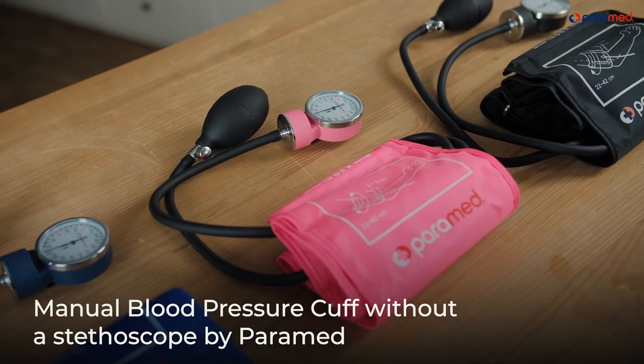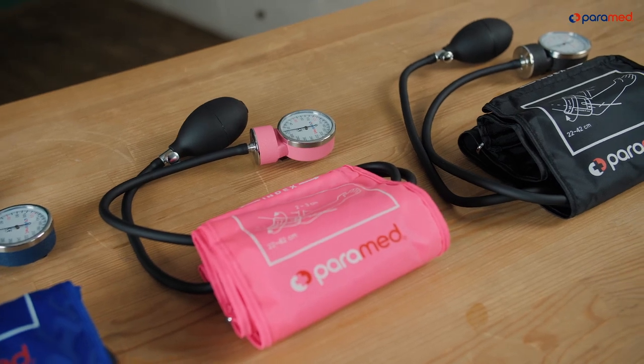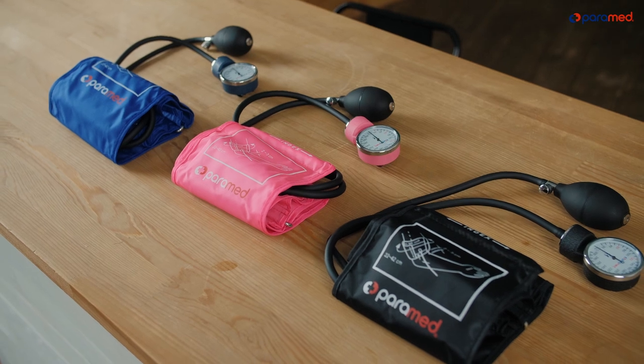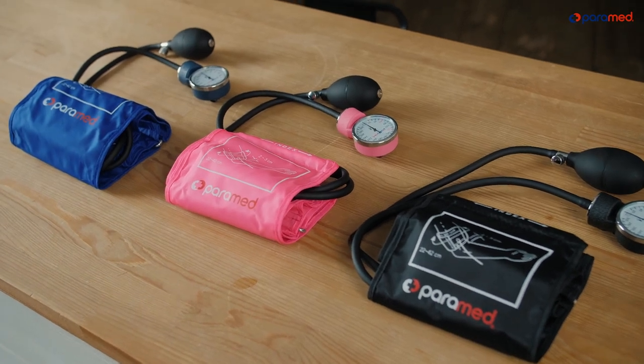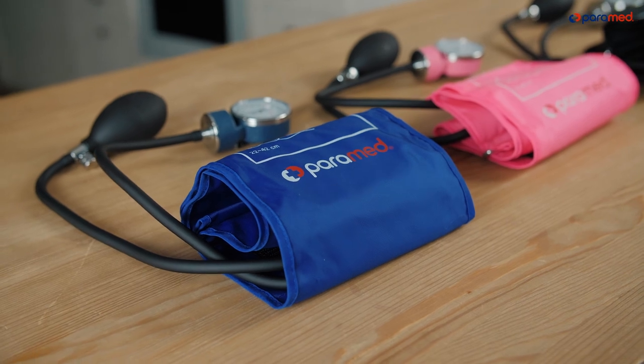Manual Blood Pressure Cuff Without a Stethoscope by Paramed. A sphygmomanometer is considered to be the most accurate blood pressure measuring device for use at home and in medical settings. The Paramed cuff is very comfortable and simple to use. Note: a stethoscope is not included with this offer — you will need to obtain one separately.